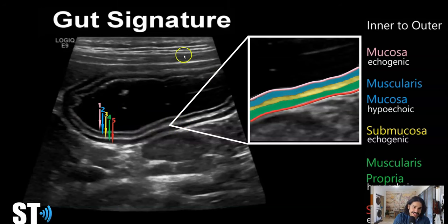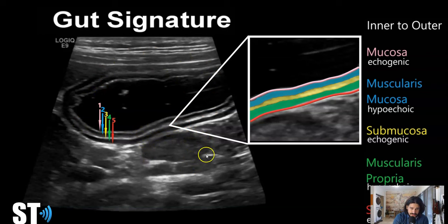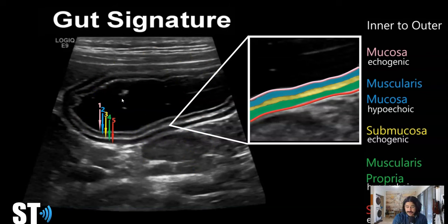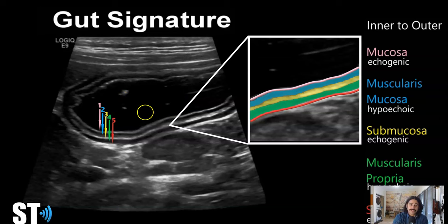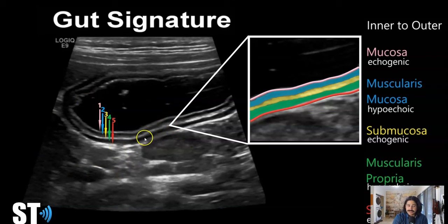This is the stomach area close to the antrum. You can see a little lymph node. This is with a linear transducer — you can get very detailed pictures. The lumen of the stomach was filled with fluid, which helps you see the layers. If there's a lot of gas in the intestines, you might not be able to see the gut signature, at least circumferentially.